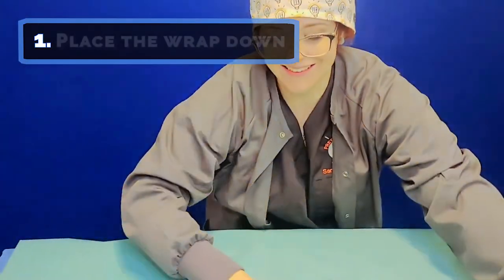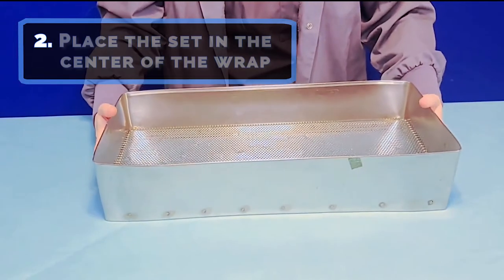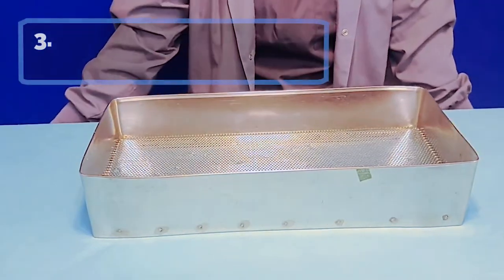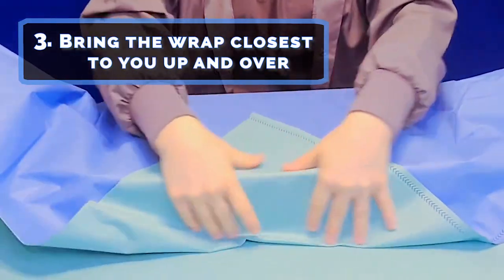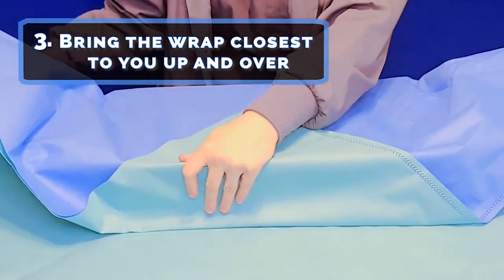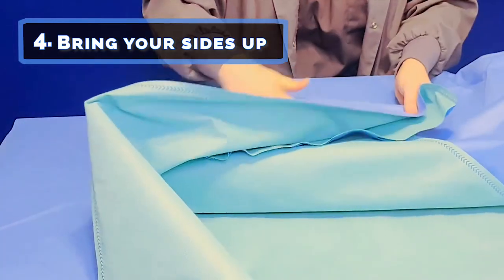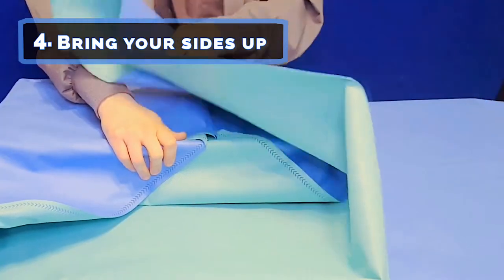Envelope fold. 1. Place the wrap down so it looks like a diamond. 2. Place the set in the center of the wrap. Check with your facility to determine if corner protectors are needed. Don't forget your integrator. 3. Bring the wrap closest to you up and over, completely covering the side of the set, and make a tag. This is crucial for aseptic technique. 4. Bring the sides up by slightly tapering the corner. It will look like your side piece is origami. Let's watch that again for the opposite side. Taper, grab, fold over, tab.